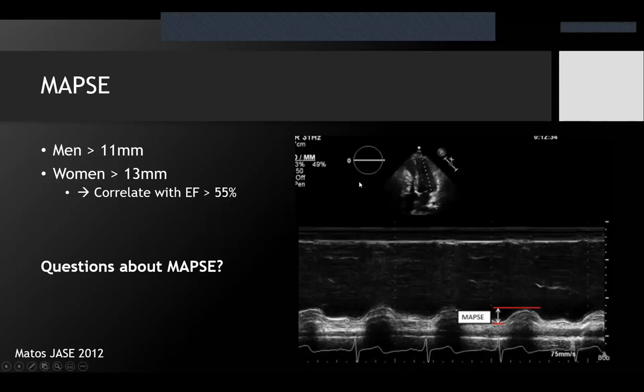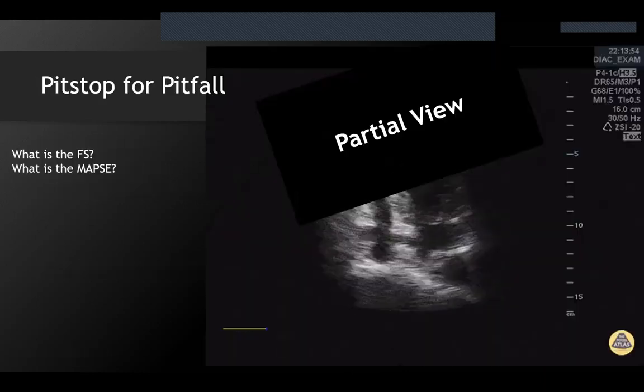So you might be getting a sense of how people eyeball with qualitative echo. You eyeball myocardial thickening, you eyeball myocardial excursion. Well, one way to quantify some degree of myocardial excursion is to look at annular excursion with a MAPSE. You eyeball chamber contraction, but one way to measure that is through fractional shortening, and it's pretty reproducible. One major limitation of MAPSE and any of these linear dimensional measures is about to be right here.